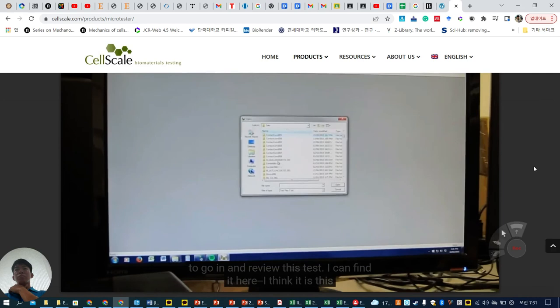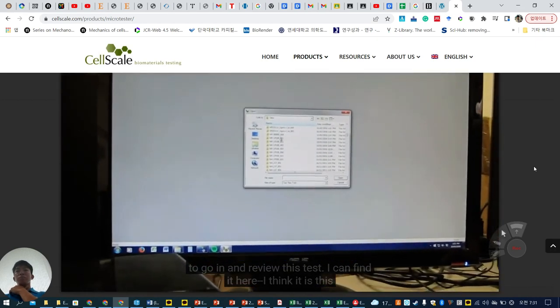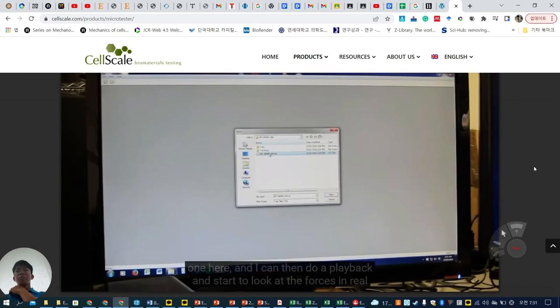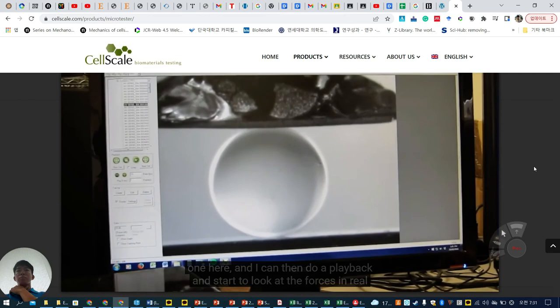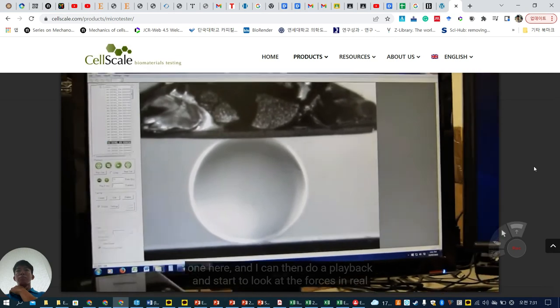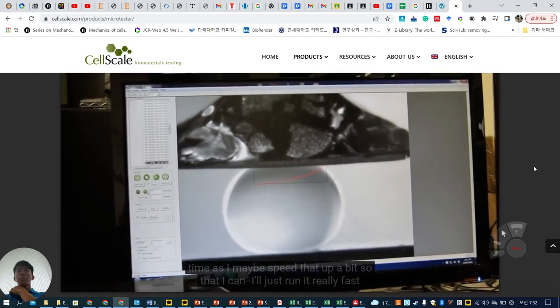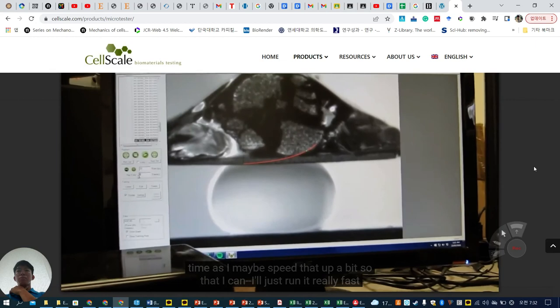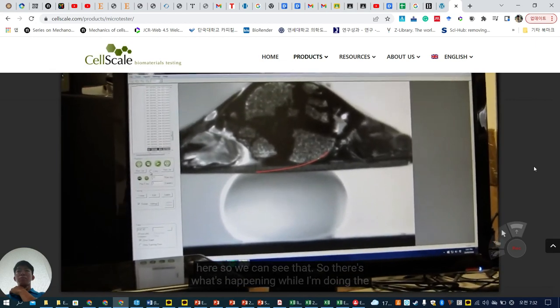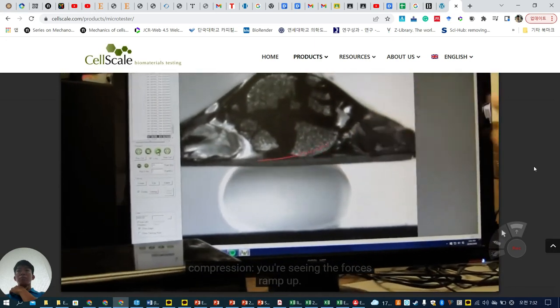If I can find it here. I think it's this one. Here, and I can then do a playback and start to look at the forces in real time as I maybe speed that up a bit. I'll just run that really fast here so we can see that. So there's what's happening. While I'm doing the compression, you're seeing the forces ramp up.